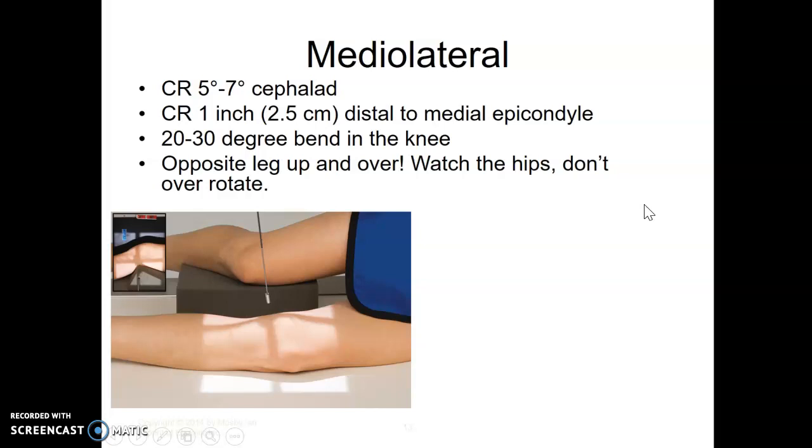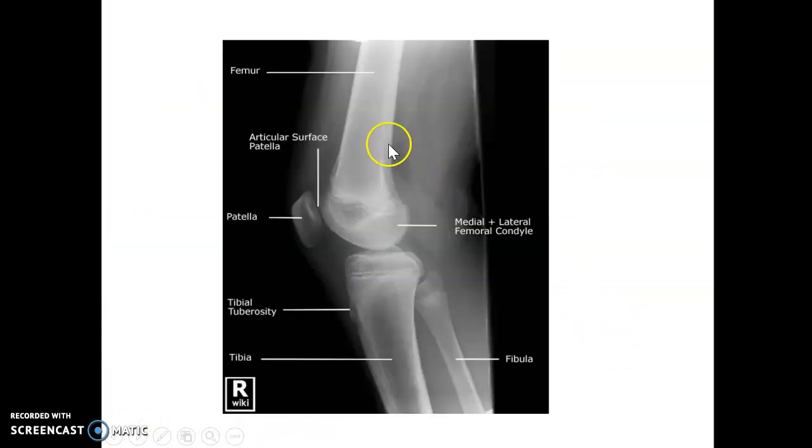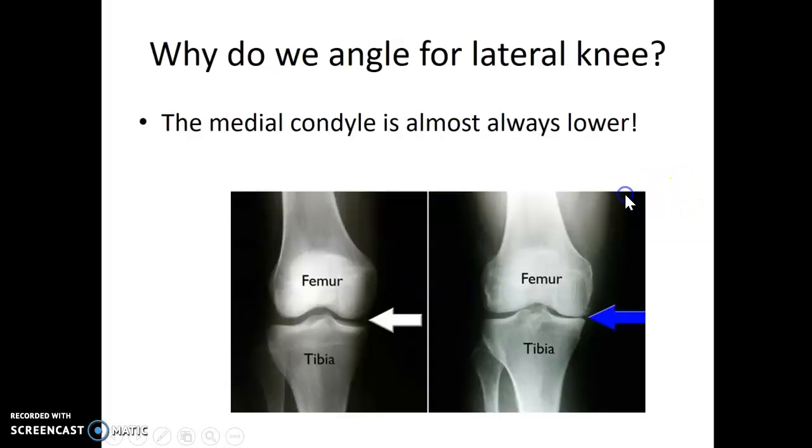Recumbent lateral. You are going to do the table bucky. Put them in lateral position. I would like this leg up and over in the front, and I'll show you why in lab, it makes it easier to find your lateral position. Central ray is 1 inch distal to the medial epicondyle. You need a 20 to 30 degree bend in the knee. Watch for the hips. Watch that they don't over-rotate. Feel straight on for that patella. This is what it should look like. Your femoral condyles should be superimposed over each other, and there should be space between the patella and the femur.